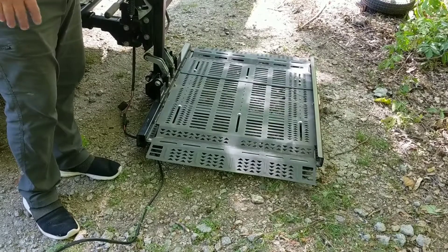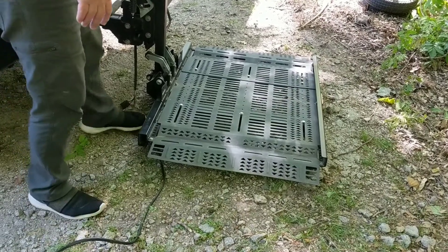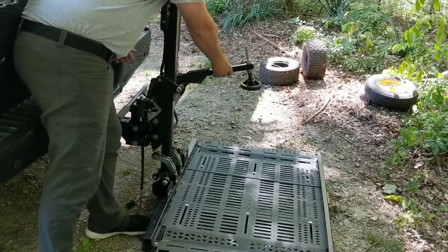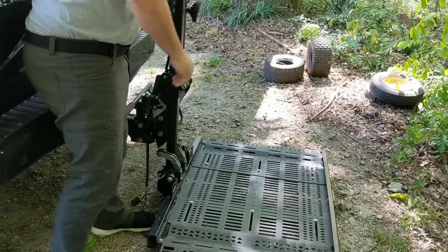Then you're ready to load. You roll your scooter up on, and then this arm will come down onto the seat of the scooter, which helps pull the scooter down.